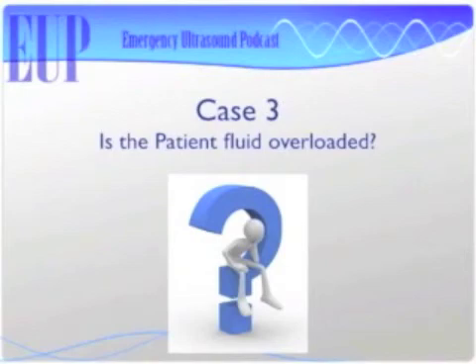But if you just threw the ultrasound on there before you did that other stuff, then you could go down that path of treating as heart failure more quickly. Yep, I could suspect heart failure as my diagnosis, because a pseudonormal pattern is definitely abnormal and could definitely account for her dyspnea. Okay. I might back it up with a BNP and a chest X-ray just to make my cardiologist happy, because I don't know if they trust me, but I'll do my best.